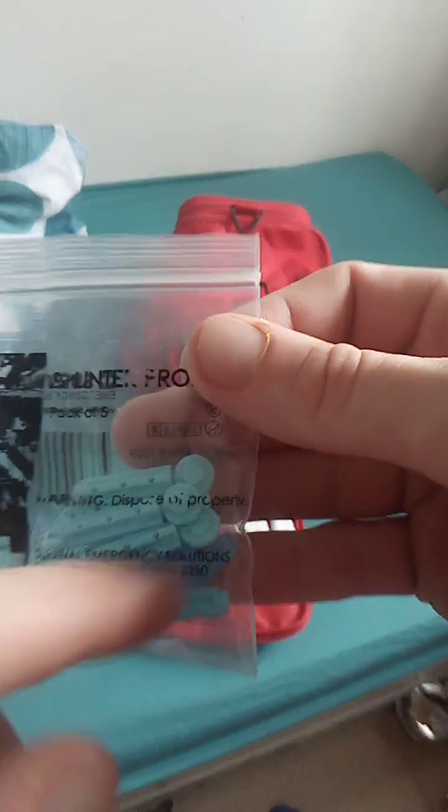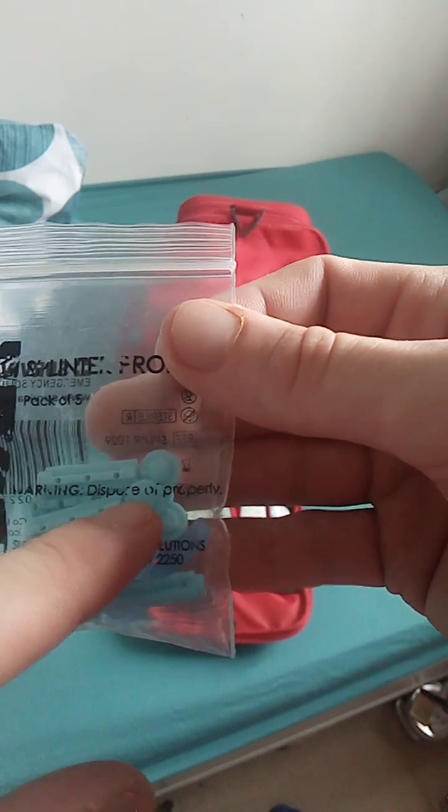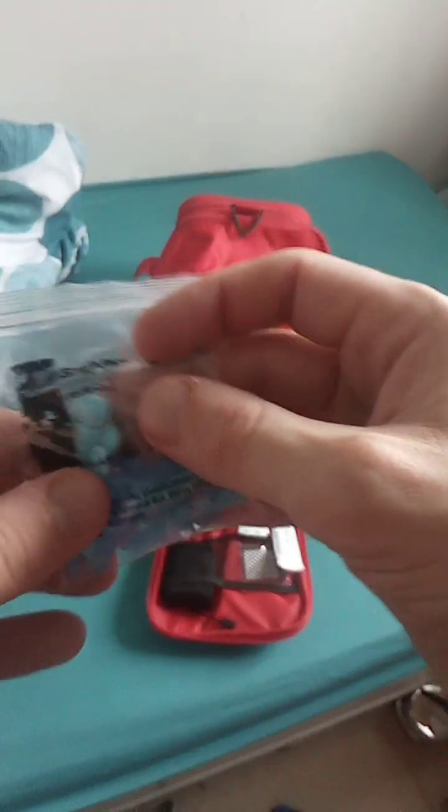These are splinter probes. So you'd rip the top off, twist it, pull it off. There's a little needle underneath - you get underneath the splinter and poke it out. Like I said, in another video I'll show you how to use some of this equipment.